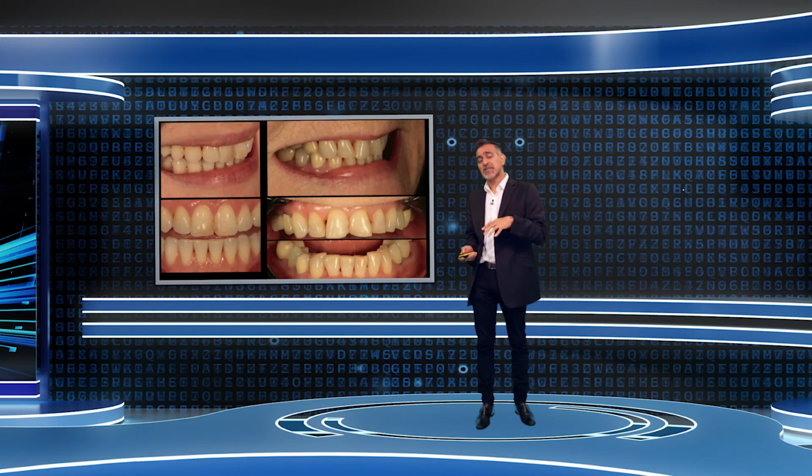What's quite fascinating is the more patients you see over time, daughters and mothers, sons and fathers, you start to see changes. And if you look at your patients, older and younger, you can start to predict what's likely to happen. This patient on the left has the classic mesiopalatal rotation of the upper centrals, constricting envelope.